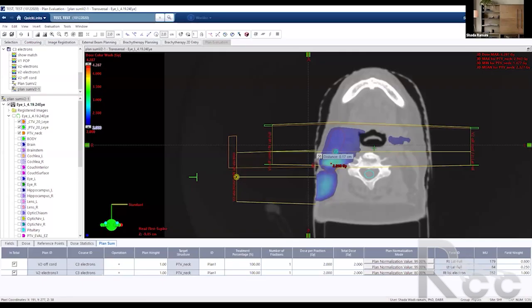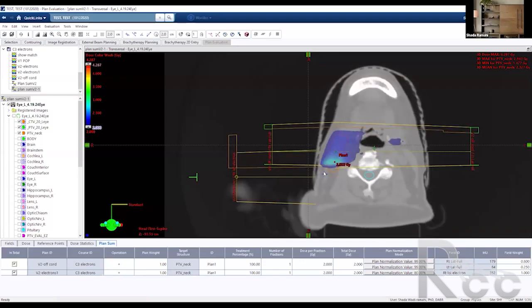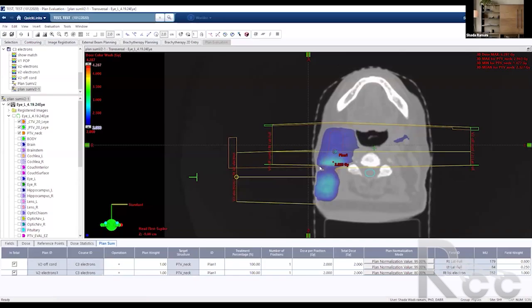Like 1.7 millimeter, not even 2 millimeter. And you could see how we have now this dip. Depending on how you set up the patient, this is not a perfect scenario, but you see, creating a gap on the skin will not remove the hotspot. The hotspot is reduced. We went from 3.3 gray down to 2.9 gray. So there is still a hotspot, and we're talking about a considerable hotspot. It did not go away. It reduced somewhat in value, and the volume is reduced.